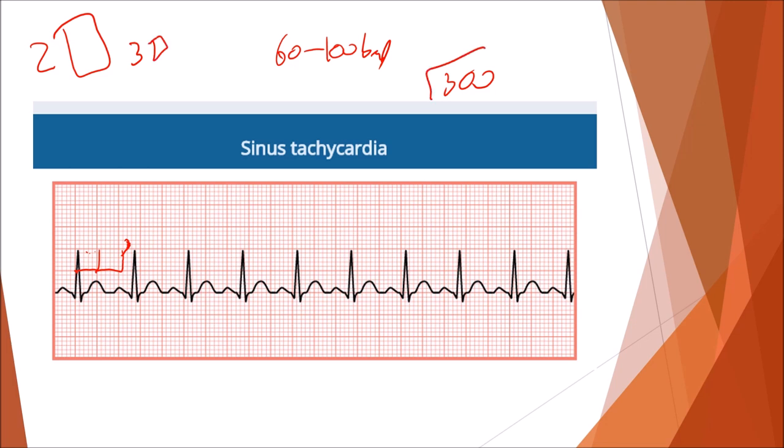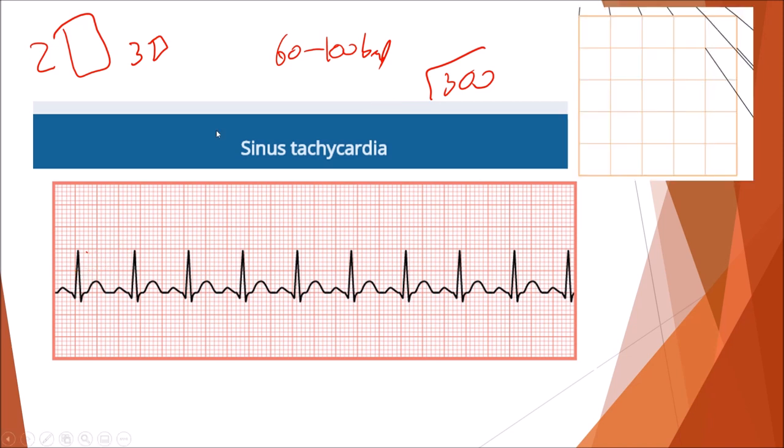Now, this is really important, we are not going to divide it by 2.3, which is what a lot of people would do. No, it gets a little bit more complicated. What we are going to do is talk about percentages. Again, this is a little confusing, but once you get the hang of it, it's really not that hard. So we know that from here to here is 100%. Right, so then that means that each square is 20%, right? Which would equal 100%. So if we have 3 little squares filled out, we are filling up 60% of the big square. So we're going to divide by 2.6.